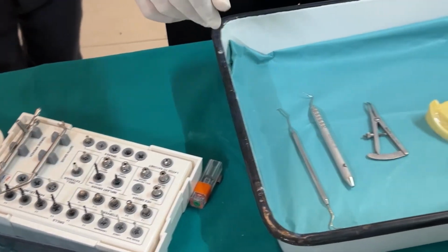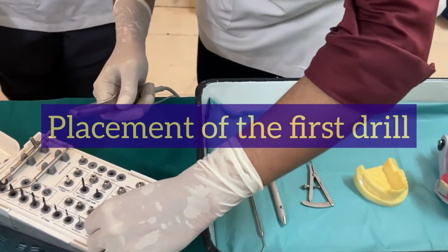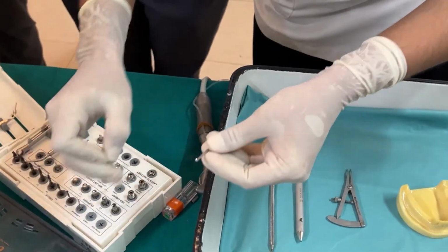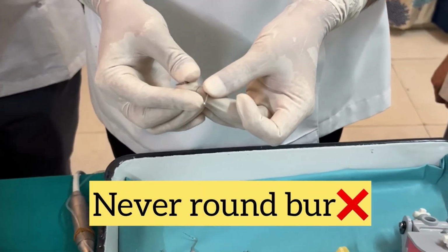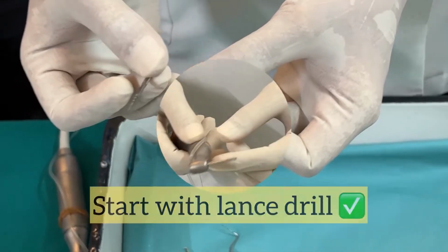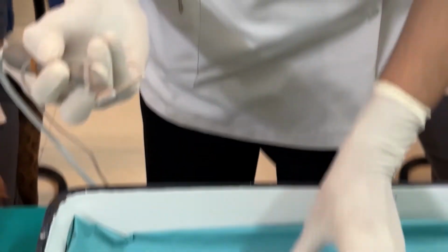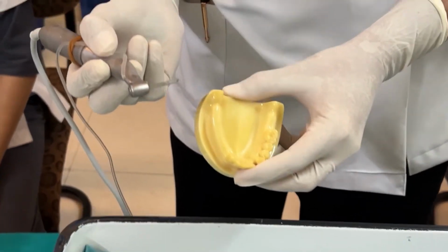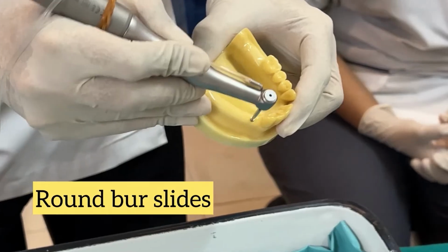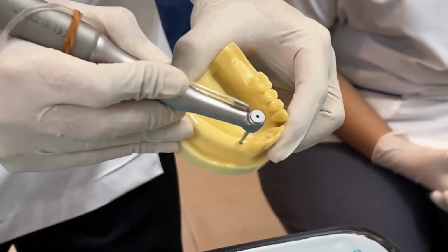Okay, so let us start with the placement of the first drill which is required. Please understand, as I covered last time, it is never ever the round burr. It is always the lance drill. The problem with the round burr is that if you use it at the low RPM of a Physiodispenser, it tends to slide a lot. So there was a time when all textbooks used to say, let's start with the round burr.